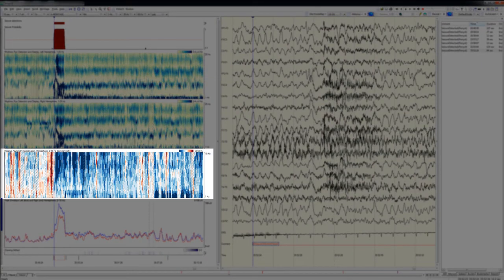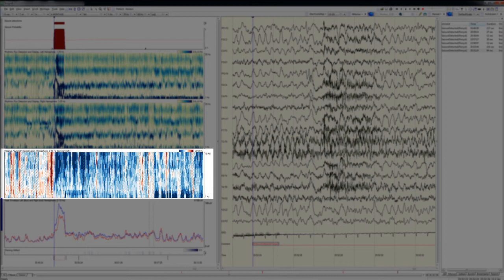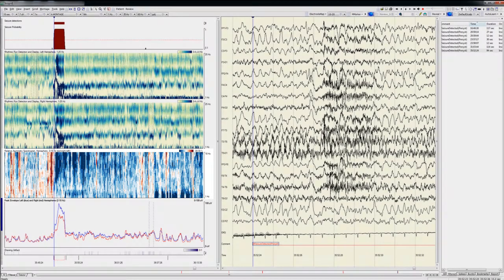The next graph shows an asymmetry spectrogram. It indicates how asymmetric EEG activity is between homologous electrodes on the left and right using a color scale that ranges from white when there is perfect symmetry to dark blue when amplitude at a particular frequency is heavily weighted towards the left or dark red-brown when the activity at a particular frequency is weighted towards the right.